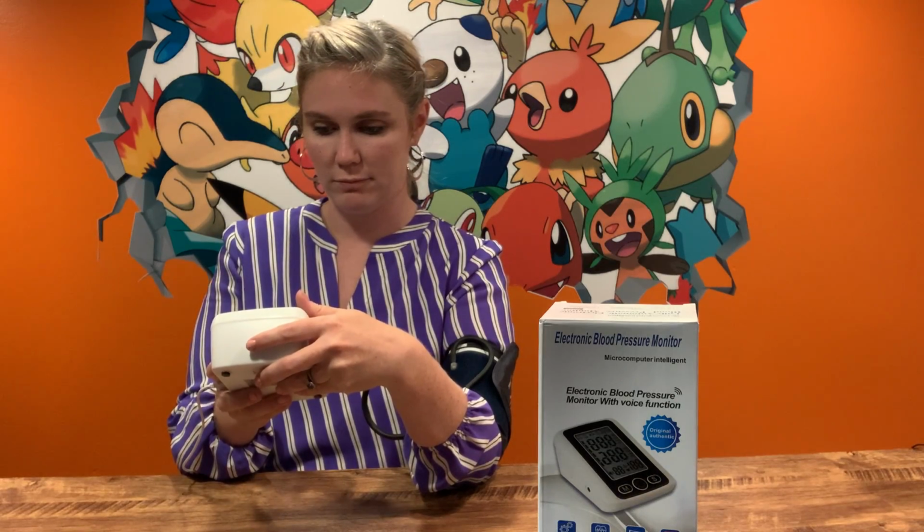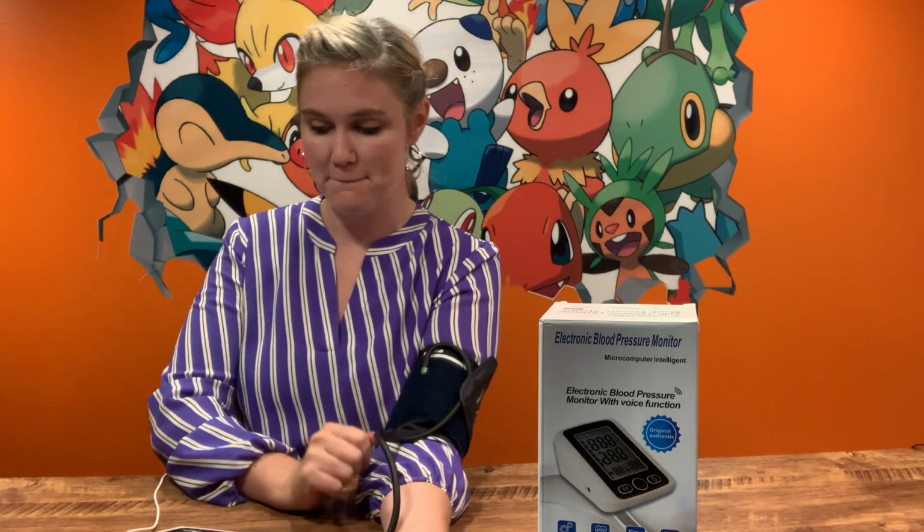Please remain seated and refrain from talking during measurement and keep cuff at the heart level.